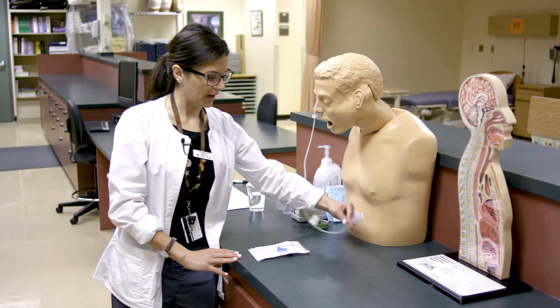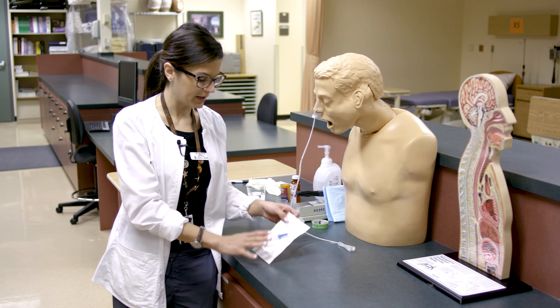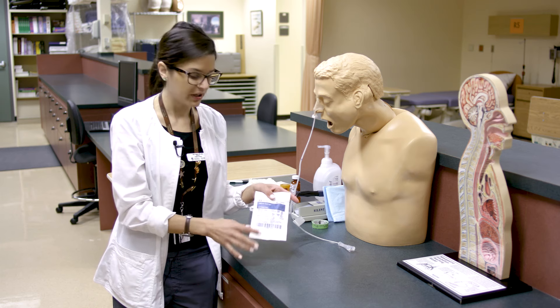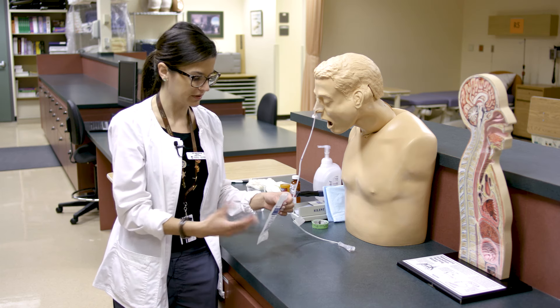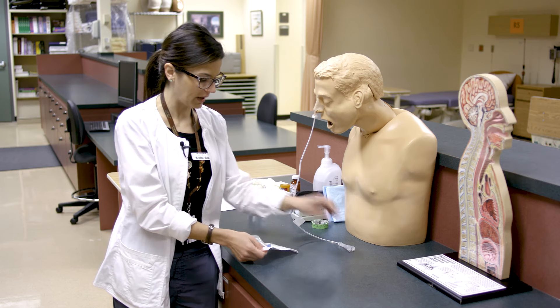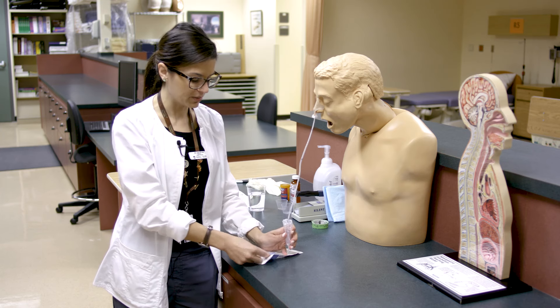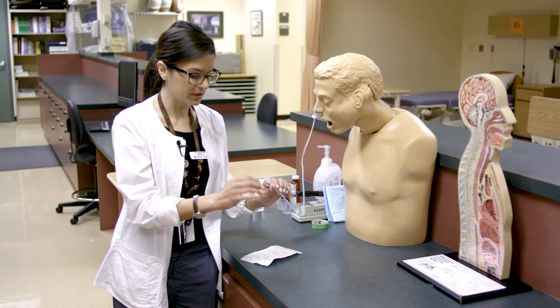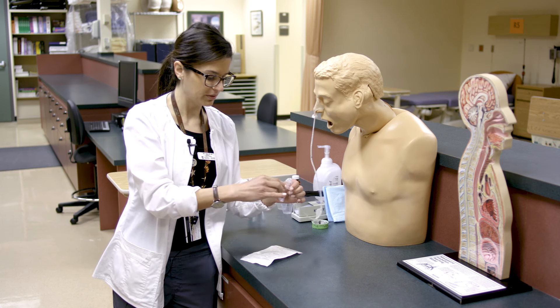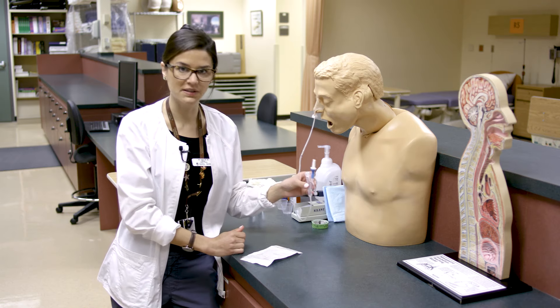Another point about this Salem sump large-bore tube is that after insertion you'll want to put in the anti-reflux valve. Unfortunately it comes in separate packaging, so you have to remember to put that in. You're going to flush the smaller lumen with air first — about 10 to 20 mls — and then insert your anti-reflux valve with the blue end in. It looks a little odd but it just stays like this.